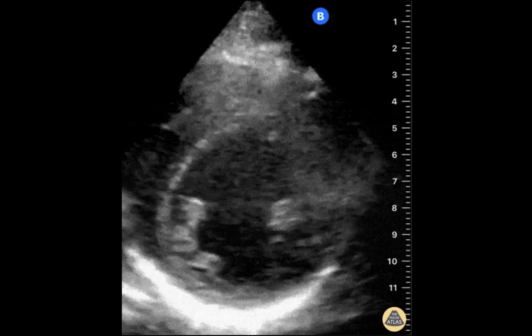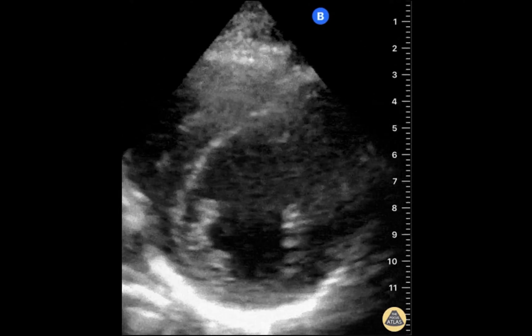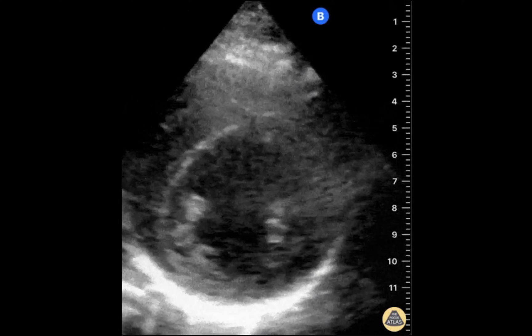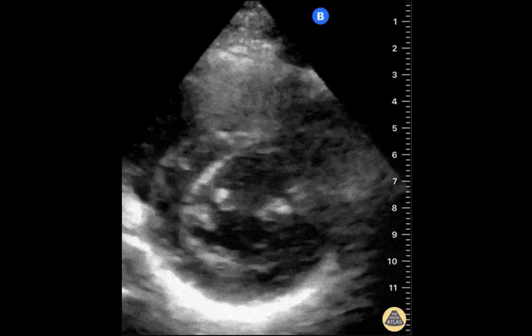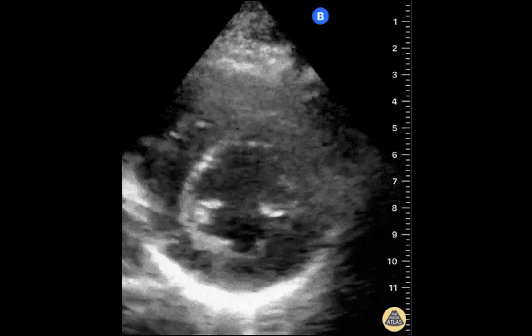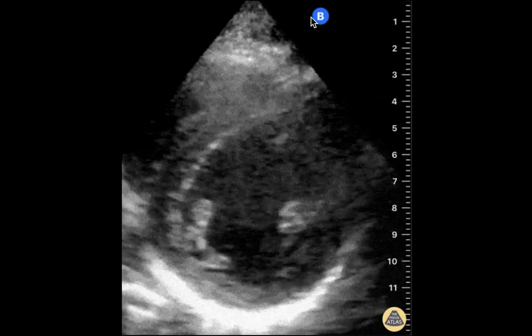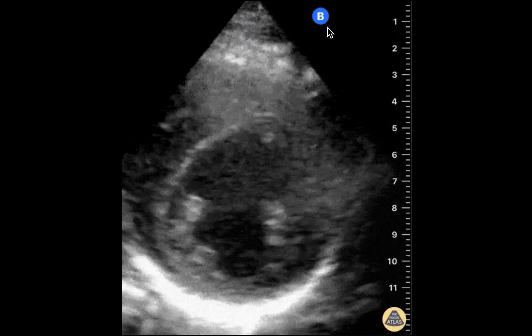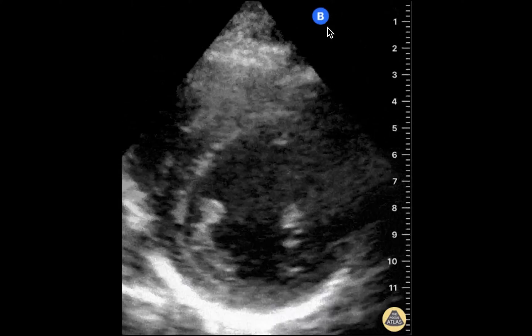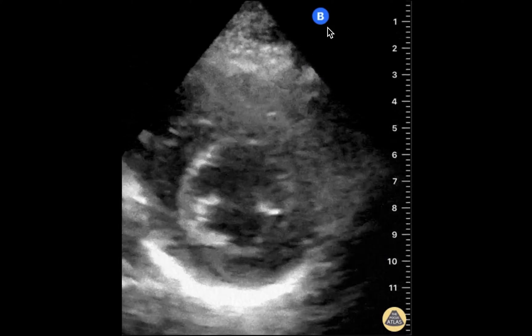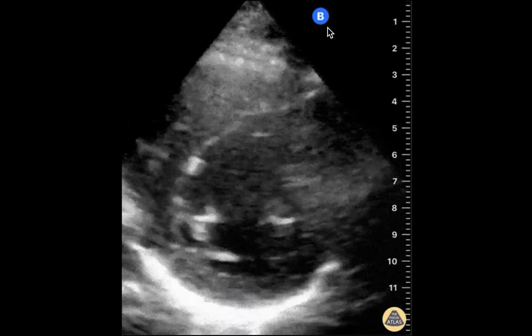Here we have a standard parasternal short axis, or PSSA, view of the heart. Note the location of the indicator dot on the right side of the screen, which means that this image was captured using the cardiology convention.